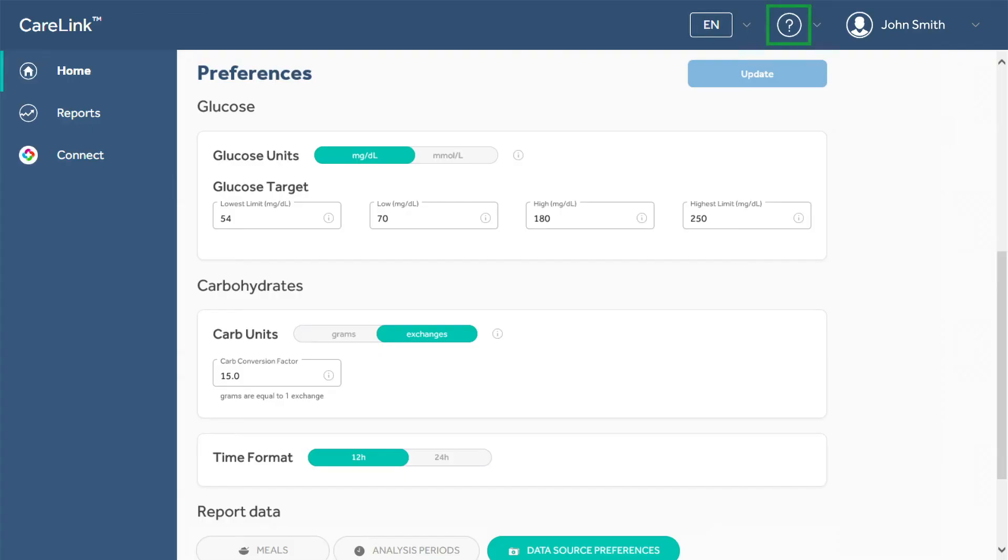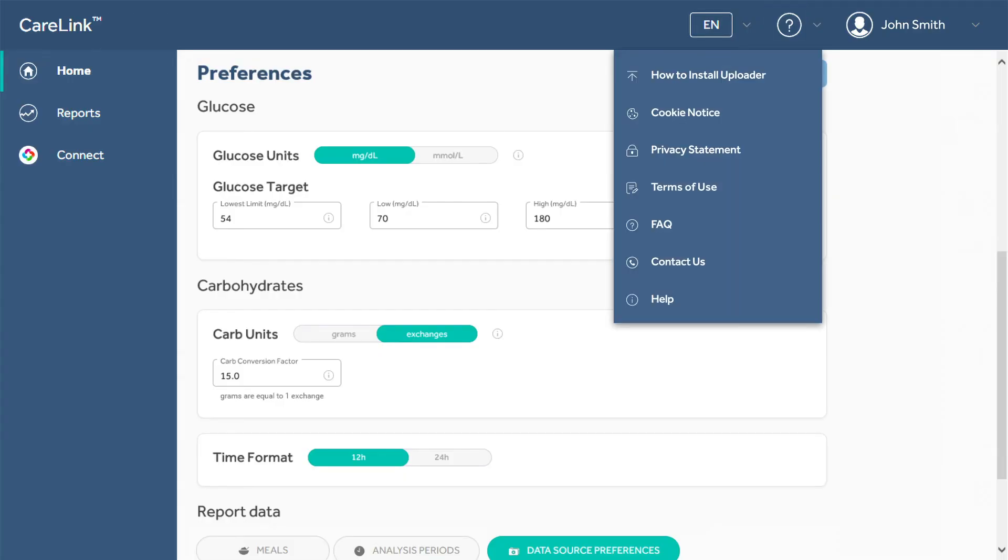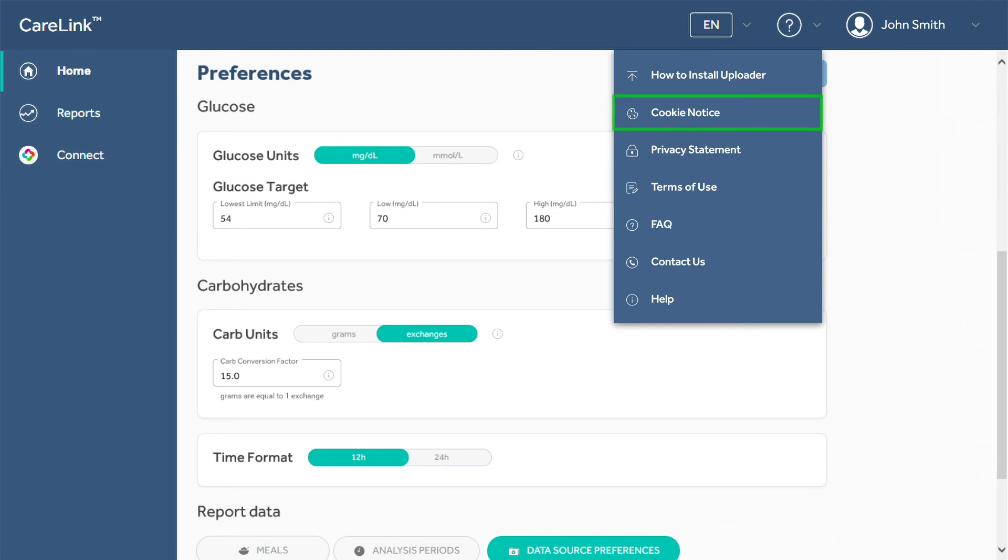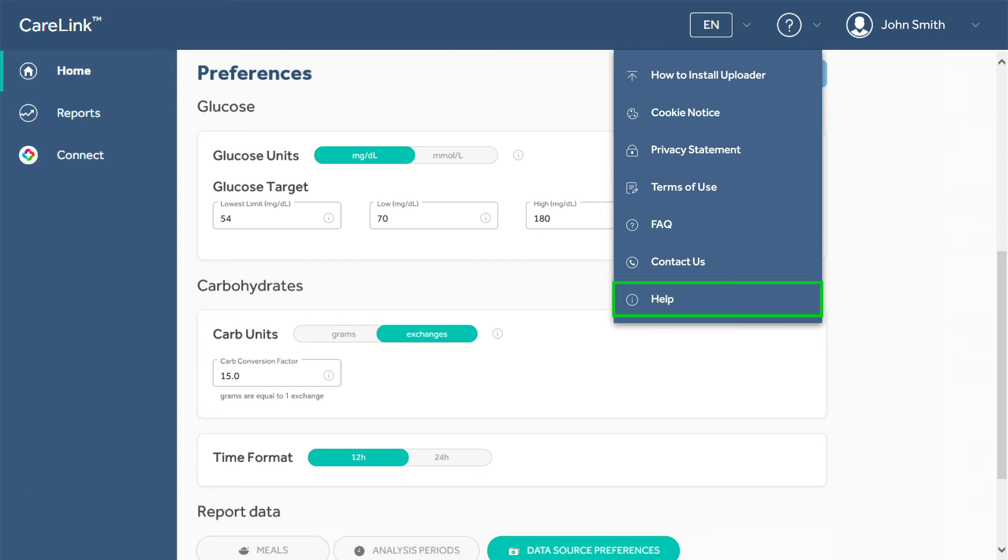The question mark icon next to your name is the Resources drop-down menu. This menu has links to instructions for installing the uploader, a menu of frequently asked questions, the full technical and privacy statements, a notice about cookies used on the site, contact information from Medtronic, and a link to the Help section.